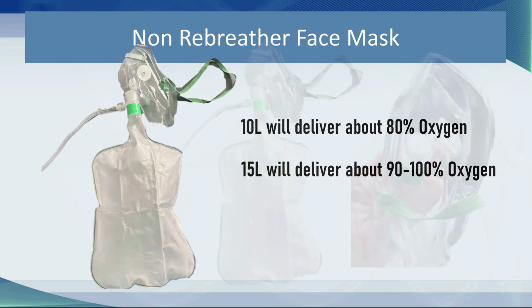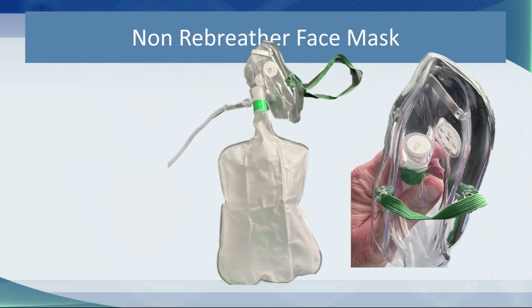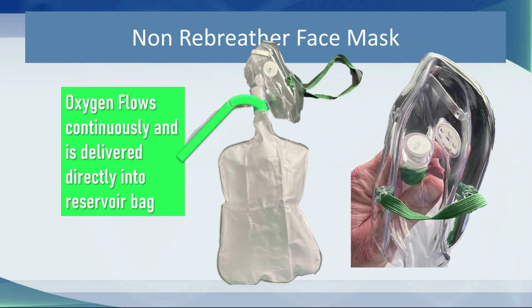And the reason why it's able to do so is because there is flow going into the device continuously. So throughout the minute you're dialing up 10 or 15 liters of flow, that flow is going in all the time. The patient only inspires for maybe 10, 15 seconds at most. So the rest of the minute you've got 10 liters per minute flowing past this inflow valve and into the bag, and the bag is filling.